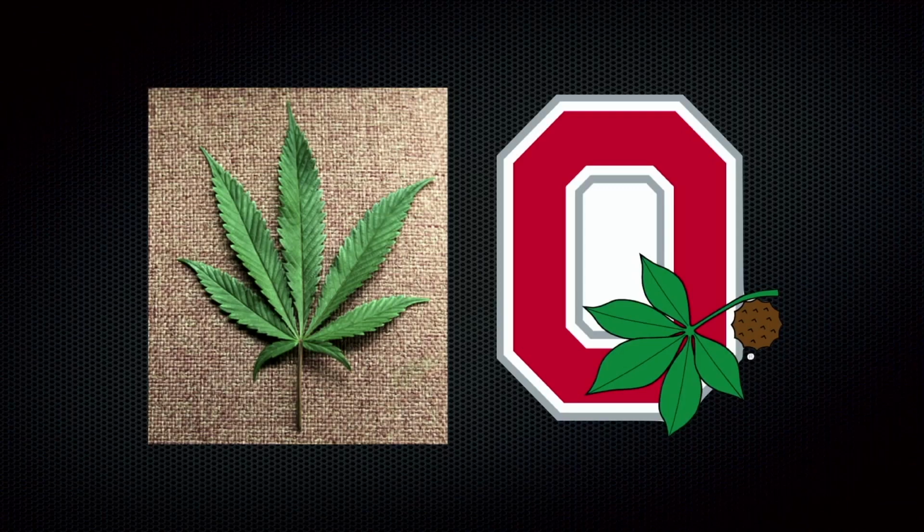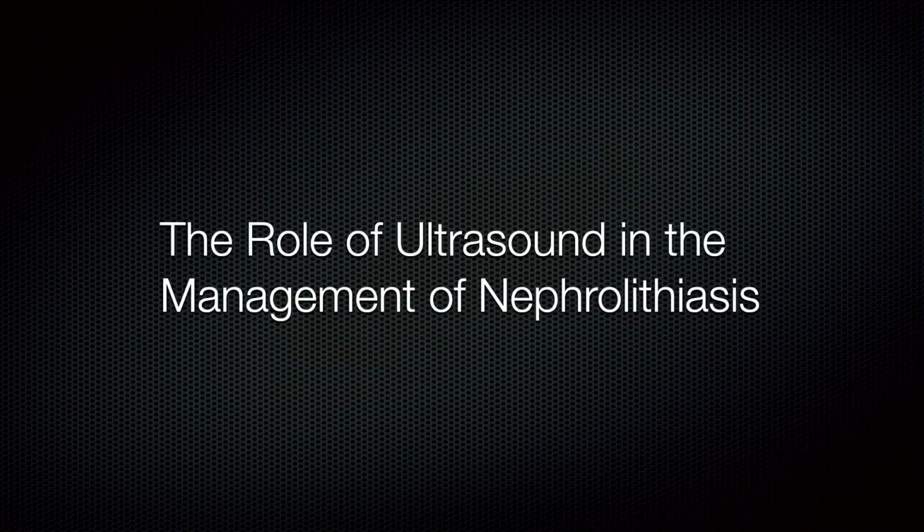So anyway, that being said, kind of moving off of that, we're going to be talking about renal ultrasound and kidney stones, really not being stoned in any other capacity. That will be a topic of conversation for some other time, not in this context with ultrasound, right? So today we're going to talk about the role of ultrasound in the management of nephrolithiasis, or kidney stones.